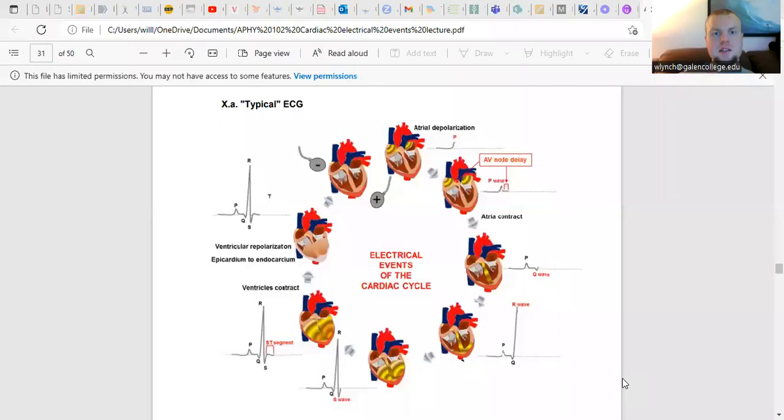So this is going to look at ECGs and what ECGs look like. Here we have a standard cardiac cycle. During this cardiac cycle, we have different repolarizations and depolarizations that happen. Now the ECG is an electrocardiogram, and that is the electrical current that the heart uses to generate contractions and pump blood. First, we start off with our atrial depolarization.